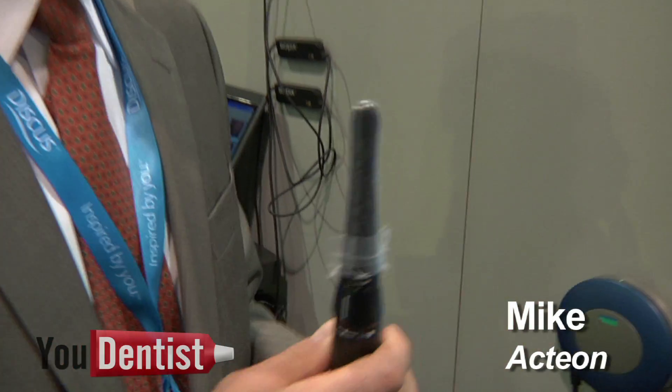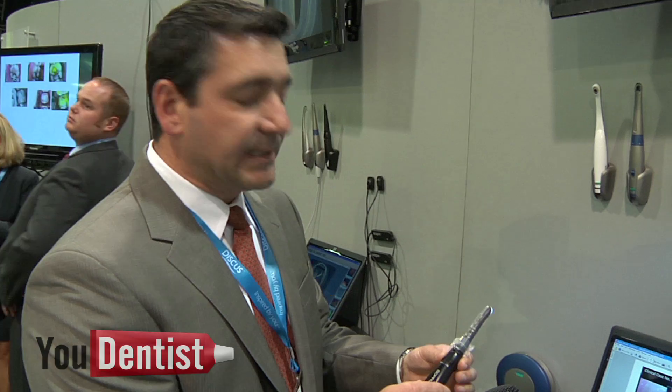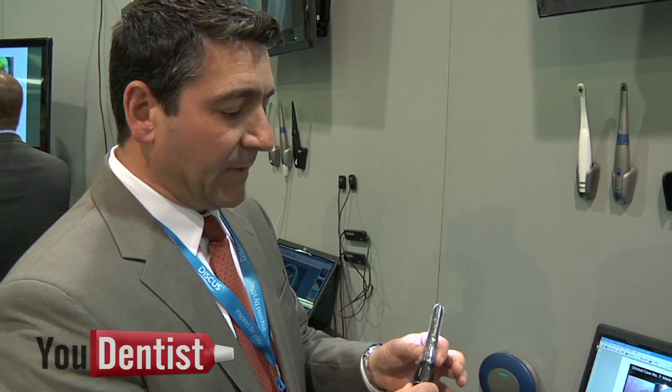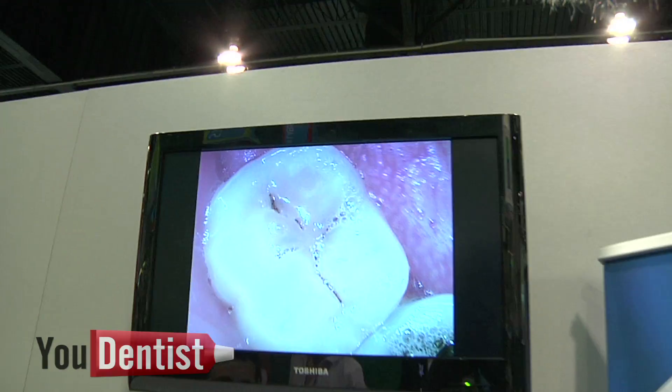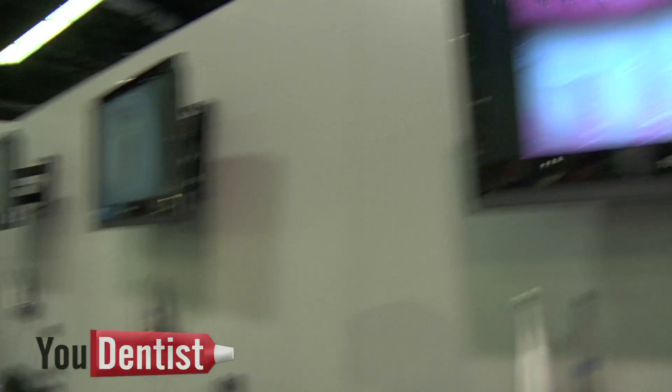It's kind of two things in one. First and foremost, it's an intraoral camera with several modes. Your intraoral mode is going to go from about five millimeters — which is one tooth — to arch or a smile, 30 millimeters. So it covers all the modes in just this one setting.